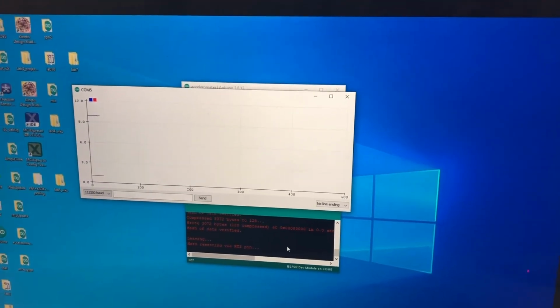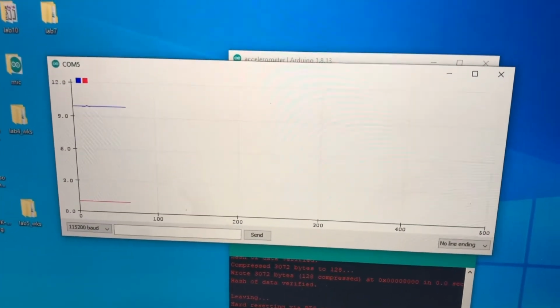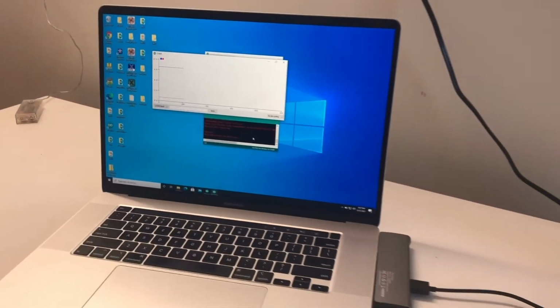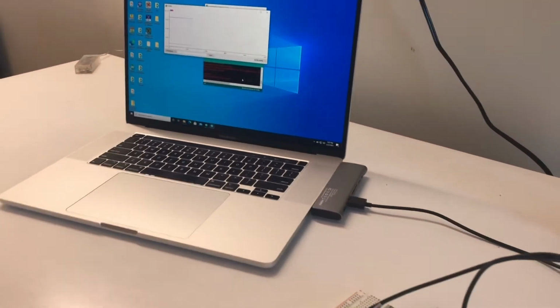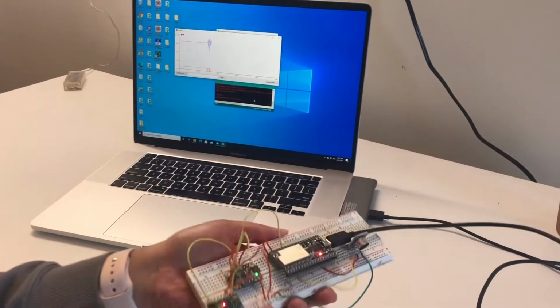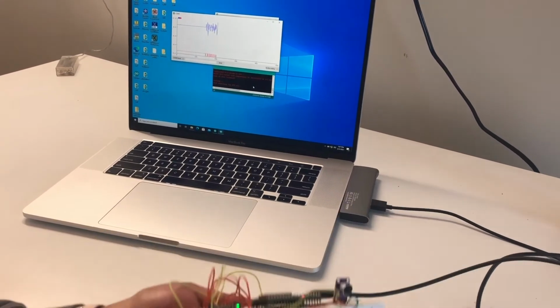The blue line represents motion, and the red line represents whether the patient is on their back or not. And so the supine value, which is in red, is a Boolean, where 1 means they're on their back and 0 means they are not on their back. And so you can observe that when I move the system, it detects motion. And so you can see the spikes.